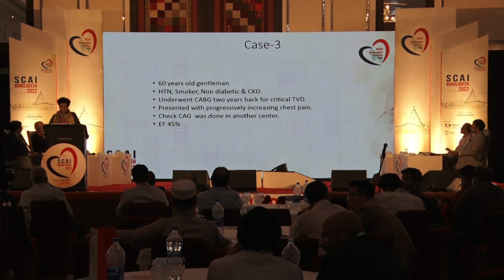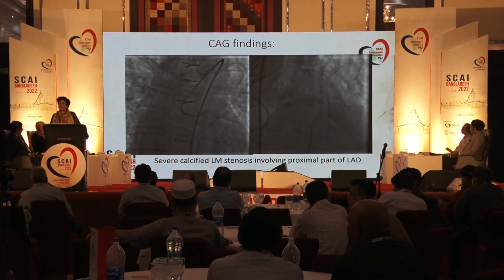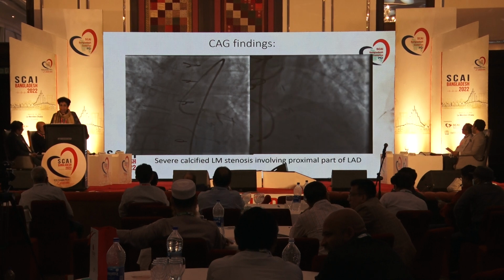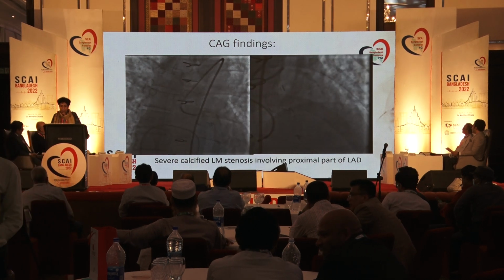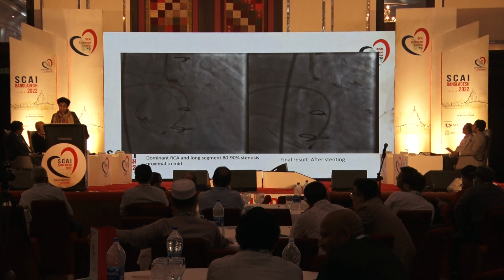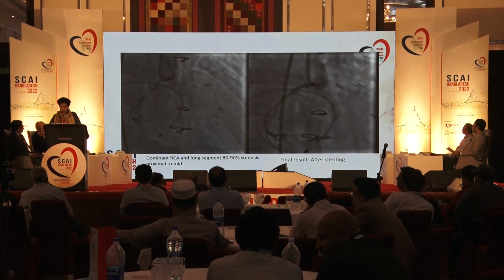Now, this third case is a gentleman who underwent CABG 2 years ago. Unfortunately, all his grafts had occluded, and we had to treat his native vessels. And he has severe native vessel disease, and you can appreciate the amount of calcium present in the left main and the LAD.